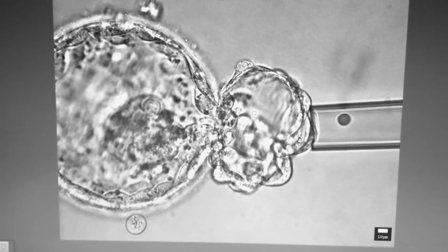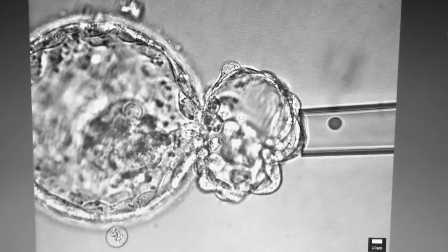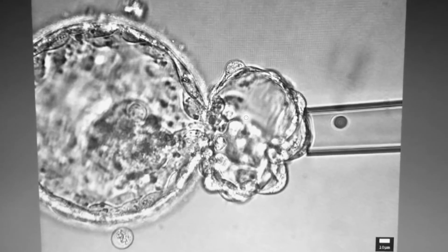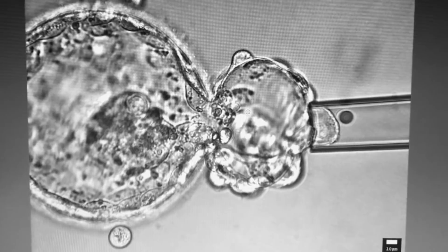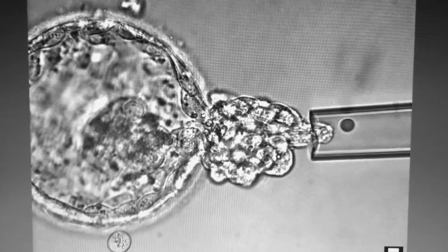In this video, we will be describing the procedure for taking a trophectoderm biopsy for doing PGS or pre-implantation genetic screening. Prior to doing the biopsy, the embryo is hatched approximately 6 hours before the procedure, at the site which is opposite to the inner cell mass.